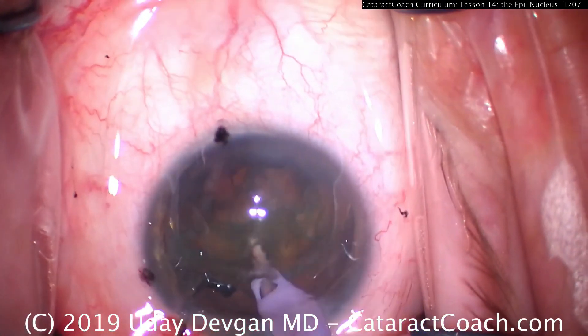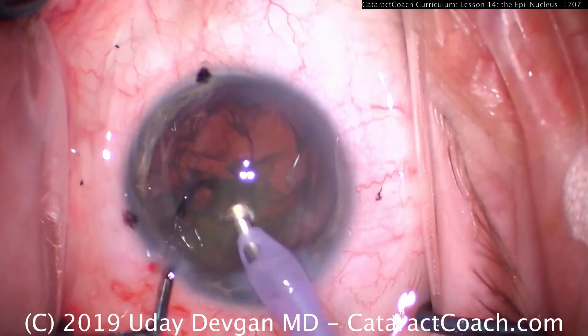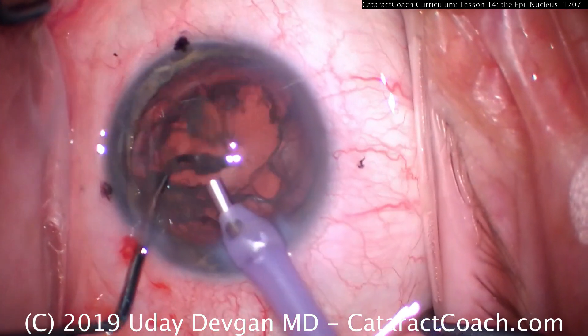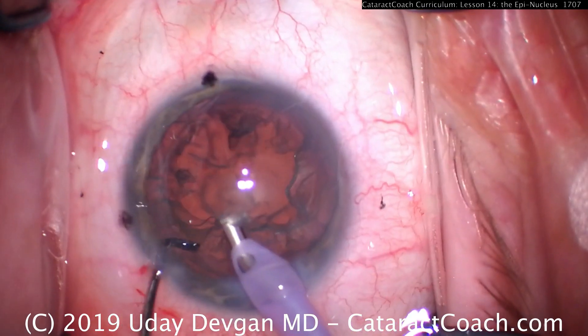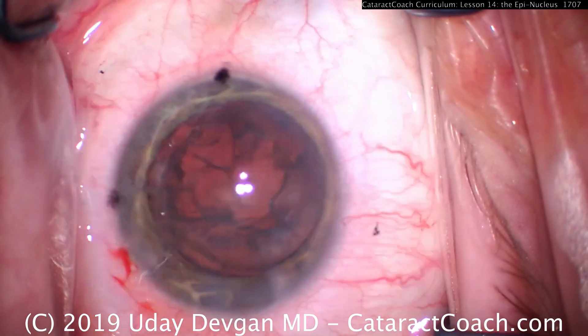Let's look at another case. Here we're towards the end, removing the last nuclear piece, and then we're taking out the one last little fragment of nucleus. There's the epinuclear shell — we want to try to engage it with just vacuum. It's too risky, so let's switch to the IA probe.